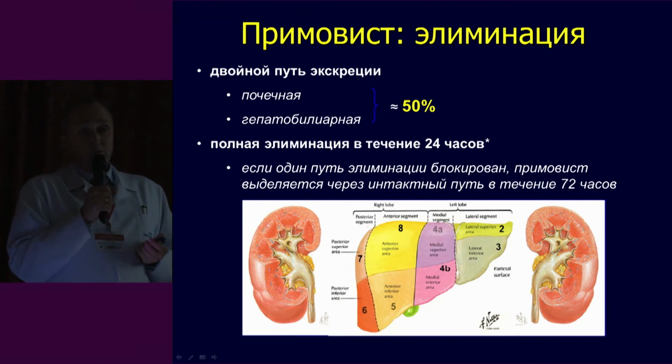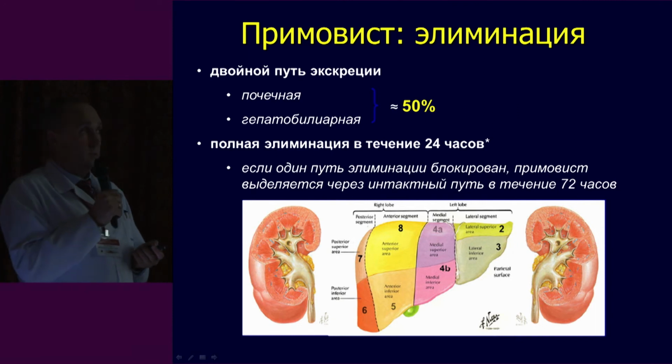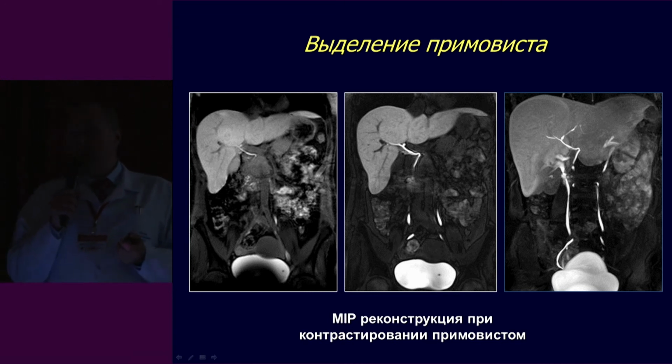In our diagnostic potential as of today, we can also use Primovist, a classical paramagnetic contrast agent that can accumulate in the unchanged tissue of the liver, which allows us not only to assess the liver structures itself, but also functionally to assess the biliary tract. It reminds us of the classical cholecystography.